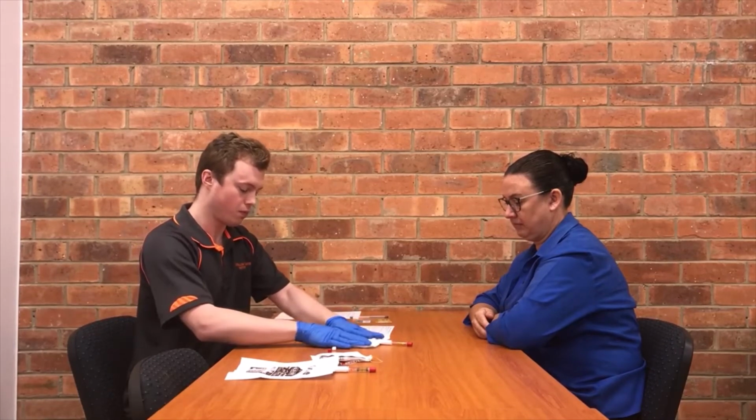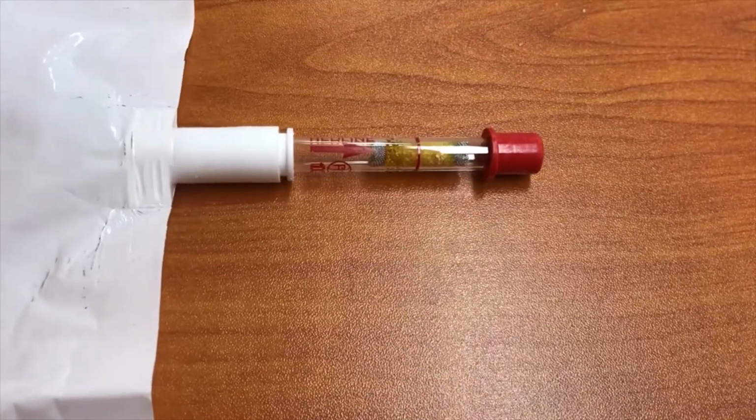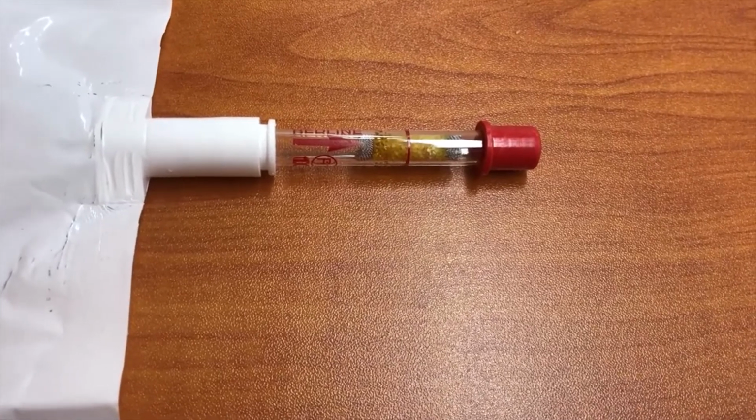Alright, now you slowly expel the air from the bag. Don't press on it too hard, just nice and gently. You'll feel it escaping into the tube. Wonderful. Perfect, and now we wait. So we've waited the 2 minutes and now we're ready to analyse our results.